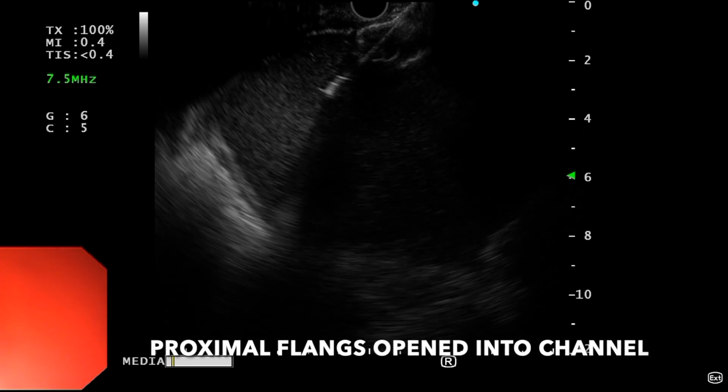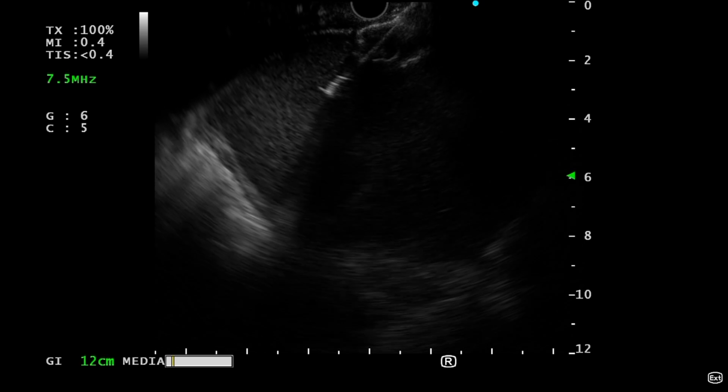Till now we have not used the endoscopic view, but now once you open, you turn to endoscopic view, turn to the right side, push the sheath down and you can see the fluid gushing out, and even you can see the proximal flange.